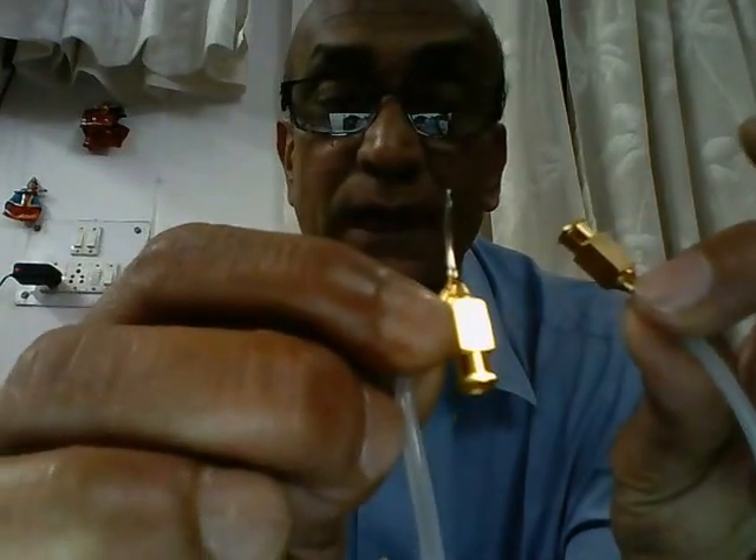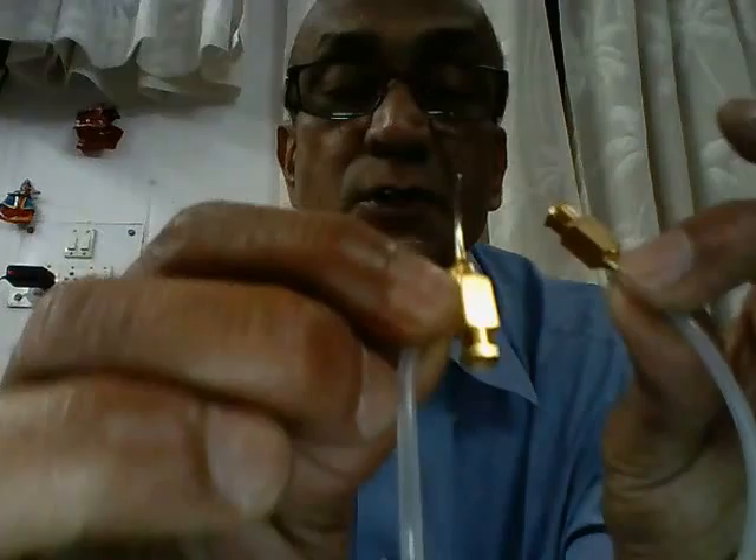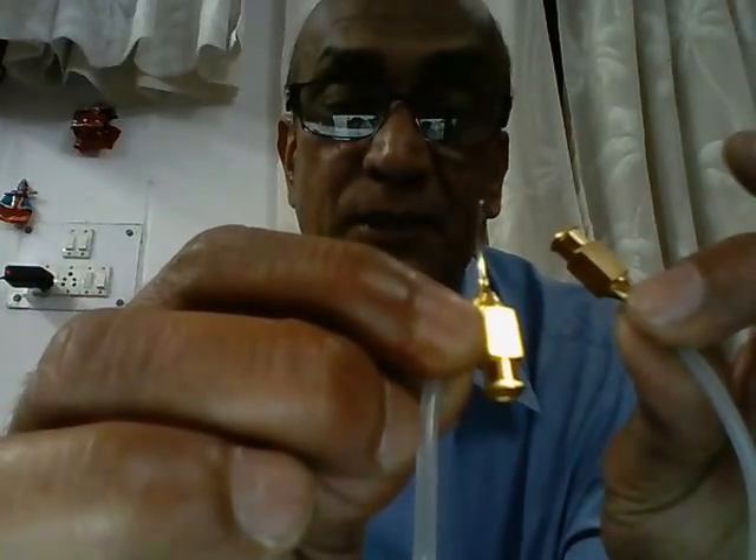This is known as the Simcoe two-way irrigation aspiration cannula.